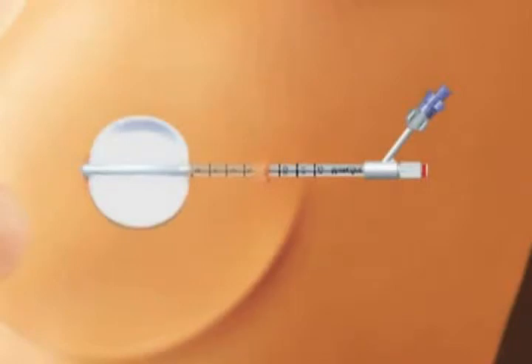During the radiation treatment, the MammoSite catheter is attached to a machine that houses the radiation source. A thin wire with a tiny radioactive seed on the end moves up the catheter under precise computer control into the center of the balloon. The seed irradiates the tumor site and the area immediately surrounding the cavity where tumors are most likely to recur.